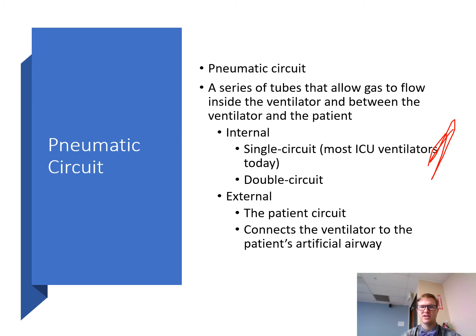It makes sense. In early generation ventilators, the exhalation valve was actually mounted on the exhalation line of the patient's circuit, right? Isn't that crazy? But with that arrangement, the expiratory valve charge line, which powers the expiratory valve, also had to be present. So there was a lot of stuff that had to be there and could be exposed to a lot of damage. But when the ventilator begins inspiratory gas flow through the inspiratory tube, the gas also flows through the charge line, closing the valves, right?